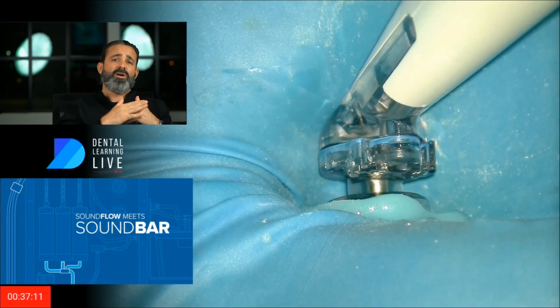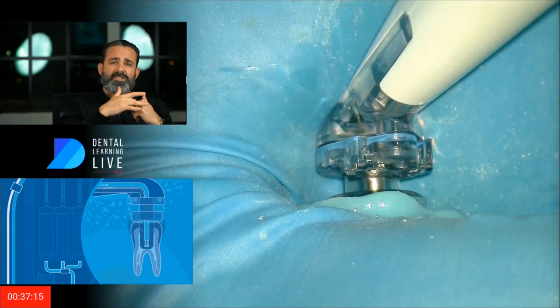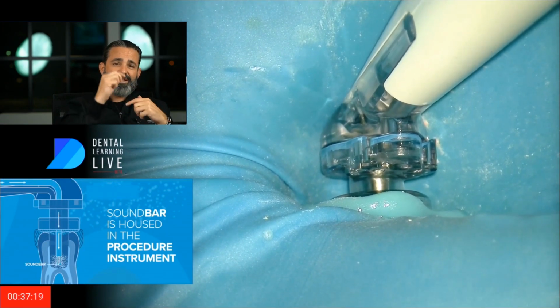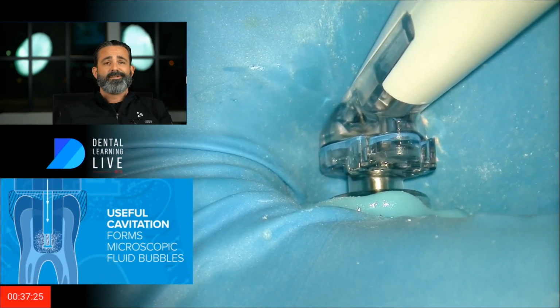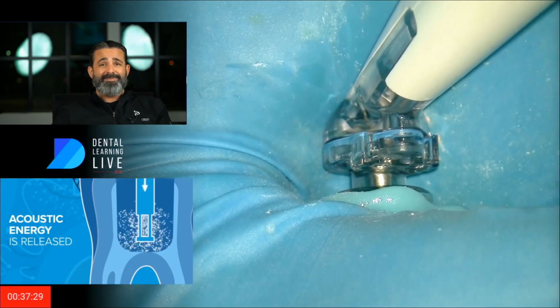So I push down really hard, and if I'm pushing down really hard, I actually want to really feel the depth gauge hit the floor. And if I do that, I'm likely bending it, or I'm really scratching it. And so for that reason, I go one shorter. That's my logic, and I've sort of adopted to that, and it works great in my hands. I don't know if that makes sense to you.